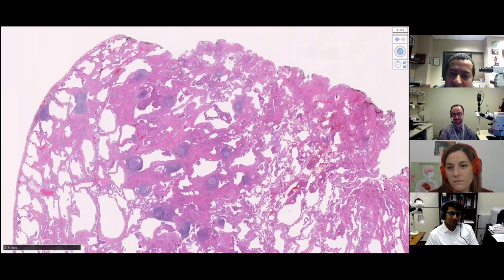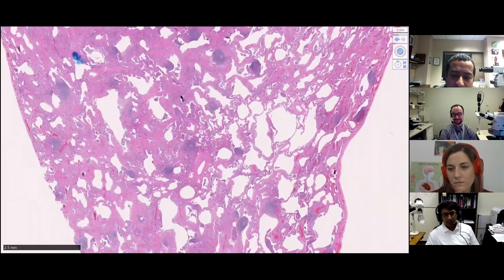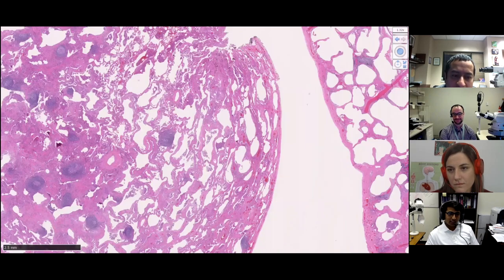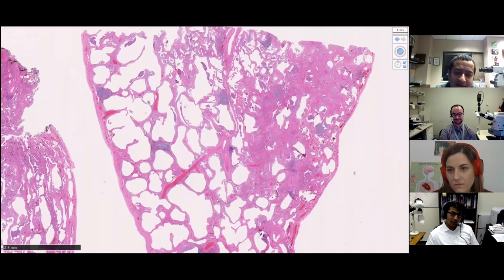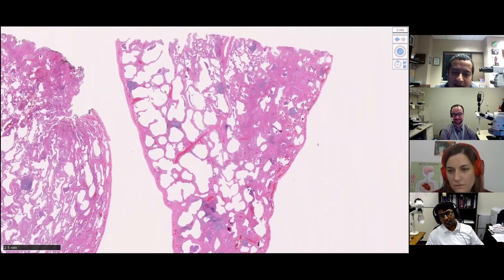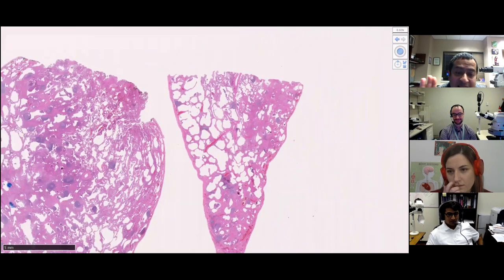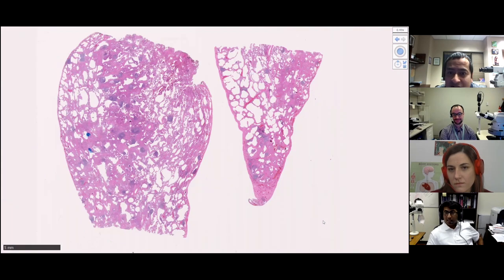I think that's acceptable as long as it's fairly diffuse. There's no scarring, no honeycomb change. Do you agree with that interpretation - no scarring, no honeycomb? I do agree that it does have an NSIP kind of look here at low mag, and there is no architectural distortion - no scarring or honeycomb changes. What I'm trying to get at is: so far it is not UIP, and all three of us would agree it's not UIP in this field.